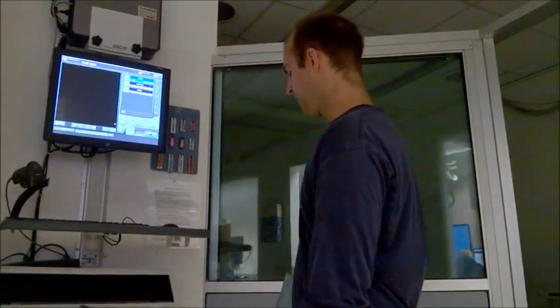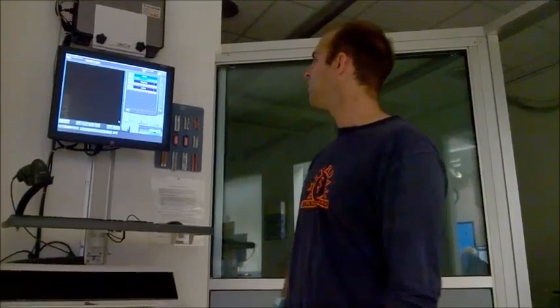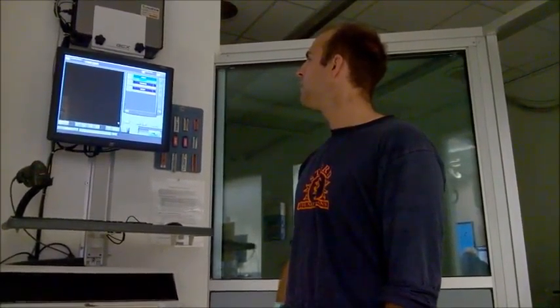My name is Vince Quality. I just got an order in from the doctor to do an orbit series, a PA, a Waters, and a single lateral of the right orbit. So I have my patient's first name, last name, date of birth, and the projection set up, and I cleaned my vertical grid and IR, and the room is all set up, detented to 40 inches longitudinally, and detented to the grid transversely.